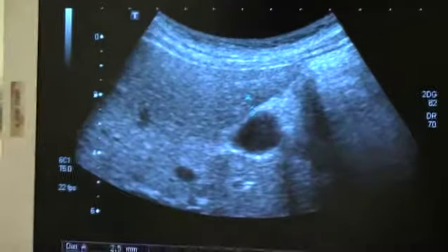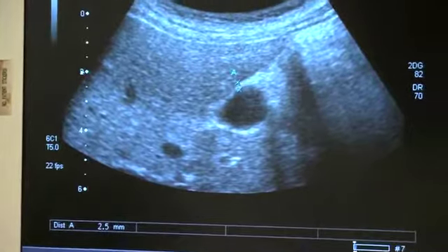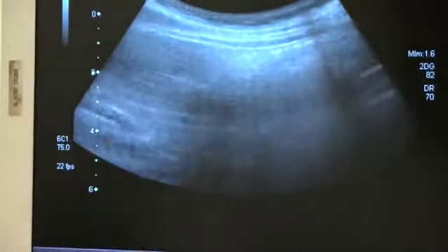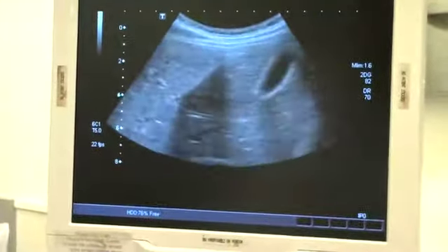So now I've got that picture saved. I've hit record, by the way, so all this is available for QA. I'm going to hit unfreeze. Now I've lost my space here, but maybe I have to change my depth a little bit more. Okay, and then I see the gallbladder again. Take a deep breath and hold it. Good. Okay, so I've got the long axis view.